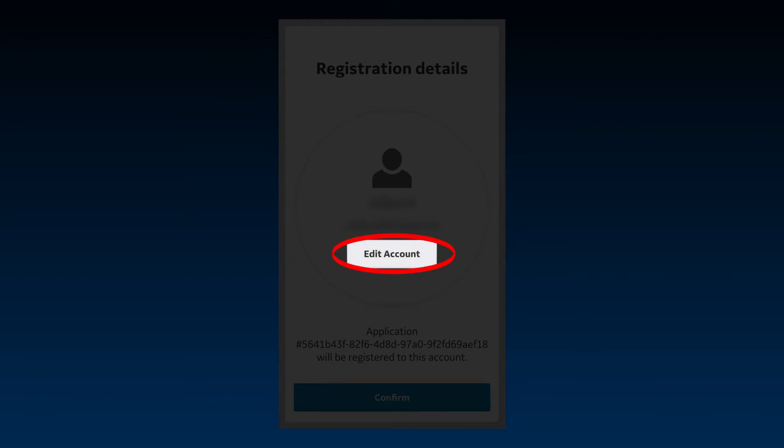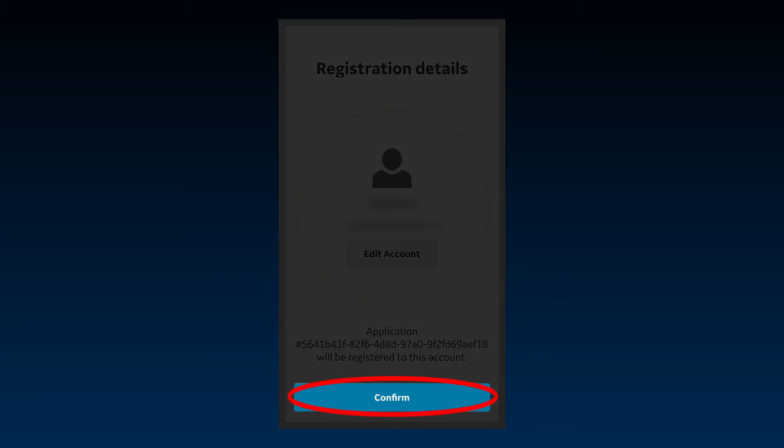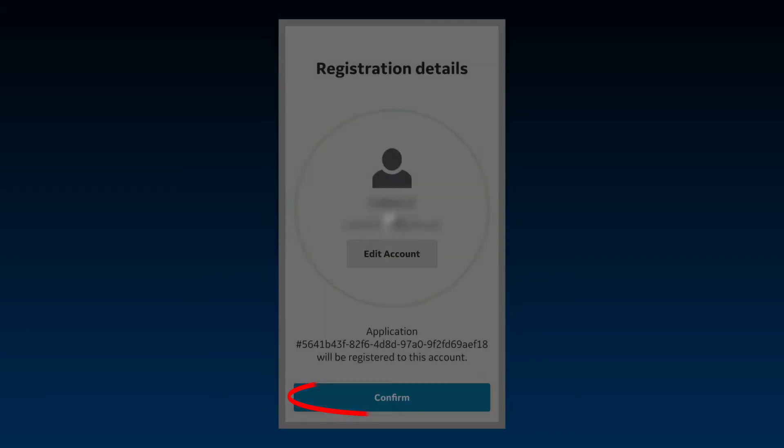Select Edit Account if you want to edit your account information. The probe and app are now registered to your account. Click Confirm.